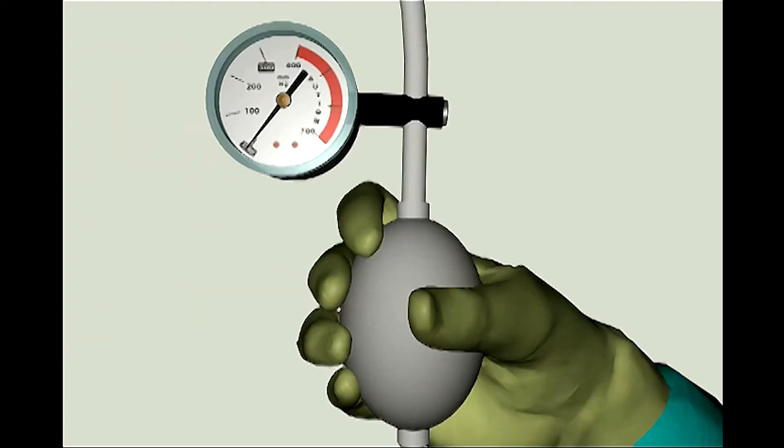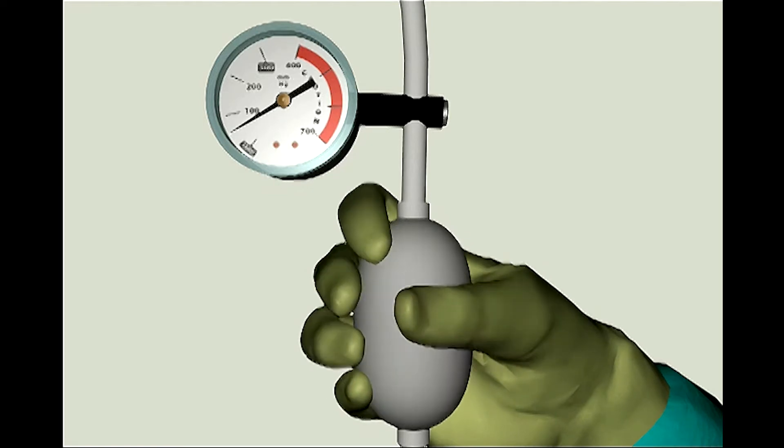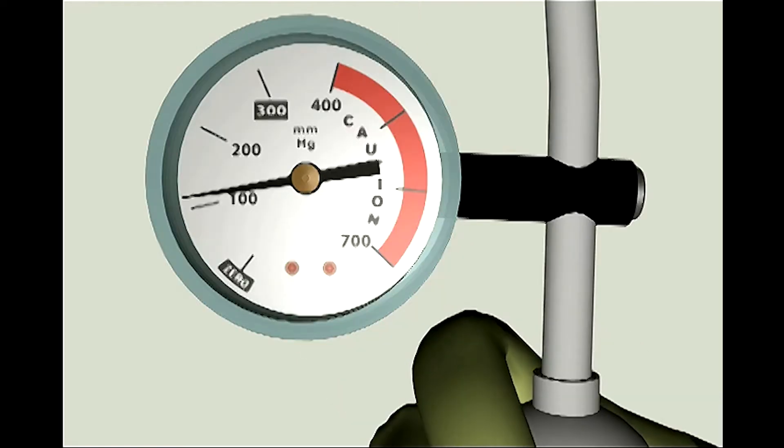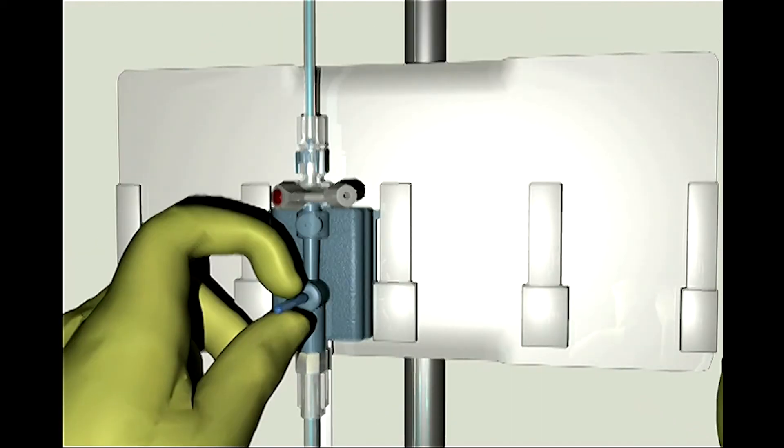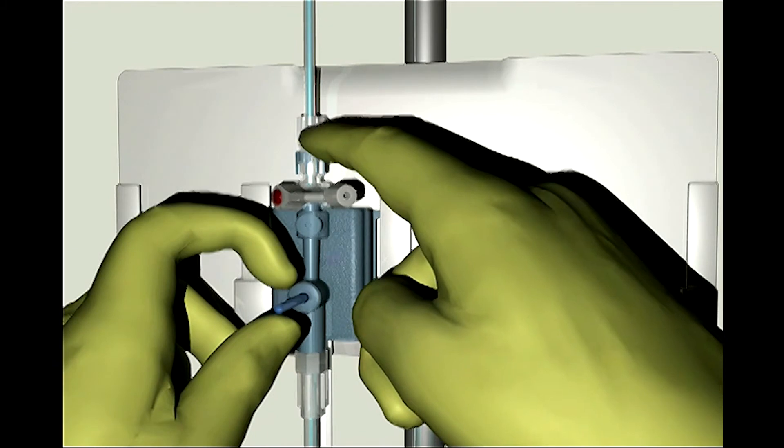Step 5: Fast flush the TruWave transducer system. Pressurize the IV flush solution bag to 300 mmHg. Pull the snap-tab to flush the system under pressure, while tapping on the tubing and stopcocks to remove any residual bubbles.